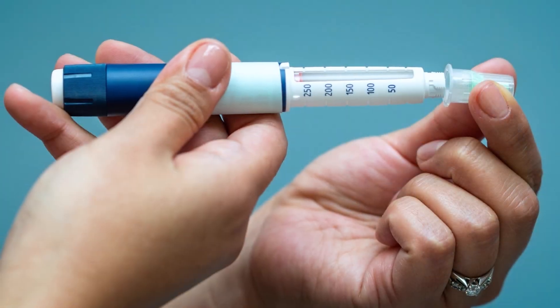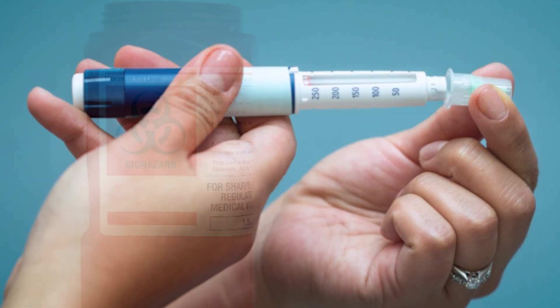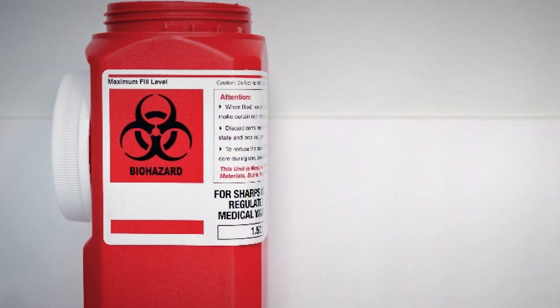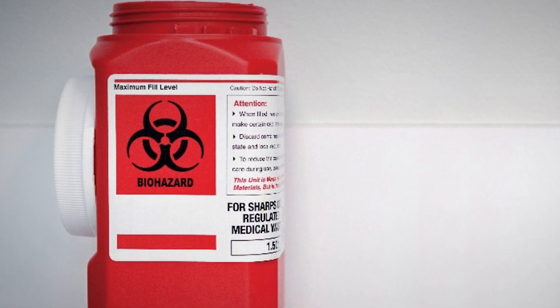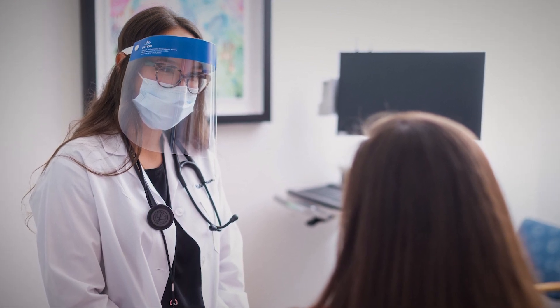Step 8: Recap the insulin pen needle with the outer cover and unscrew the pen needle off the pen. Throw away the needle in a sharps container. Once your sharps container is full, seal the cap with tape. Properly dispose of the container or take it to a local pharmacy for disposal. Talk with your diabetes care provider if you have any questions about how to inject insulin.